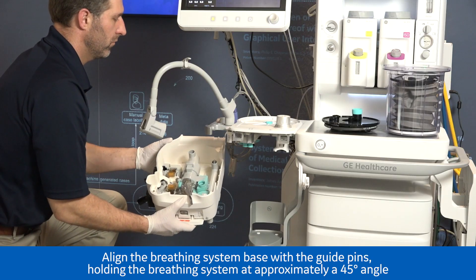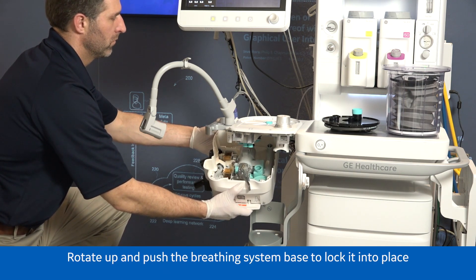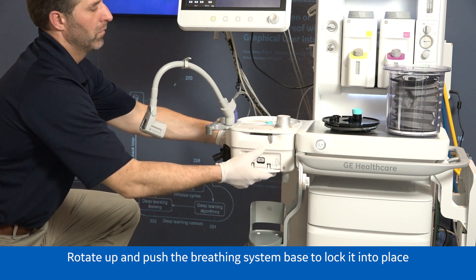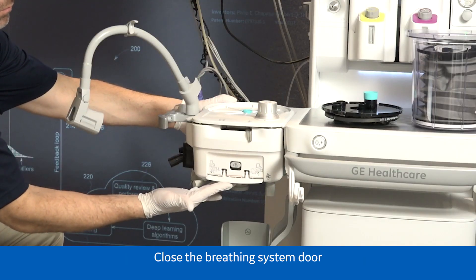Align the breathing system base with the guide pins, holding the breathing system at approximately a 45 degree angle. Rotate up and push the breathing system base to lock it into place. A click sound will be heard when attached properly. Close the breathing system door.